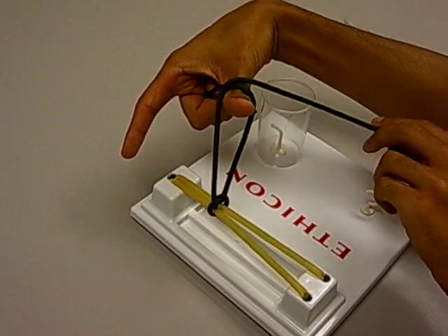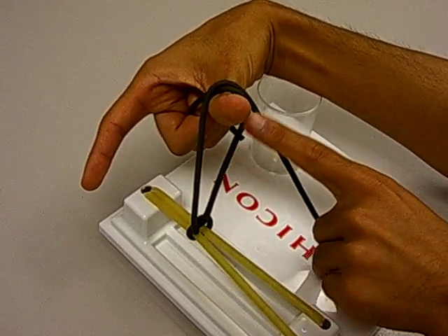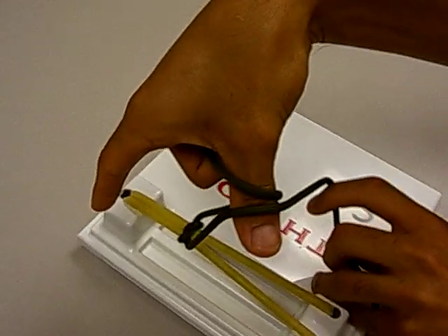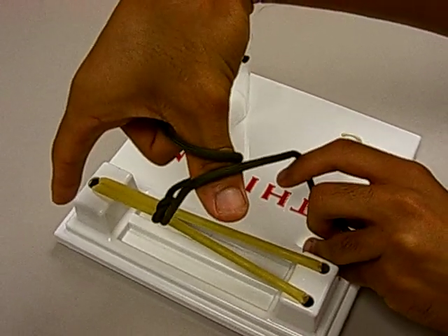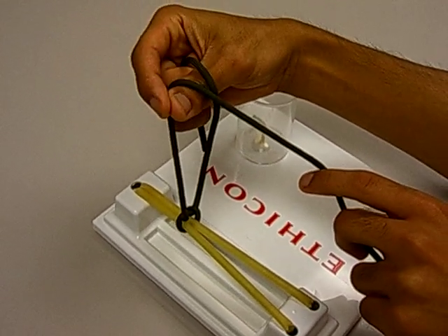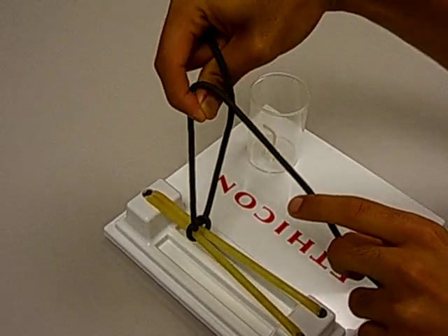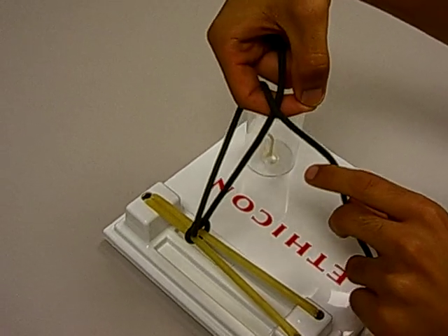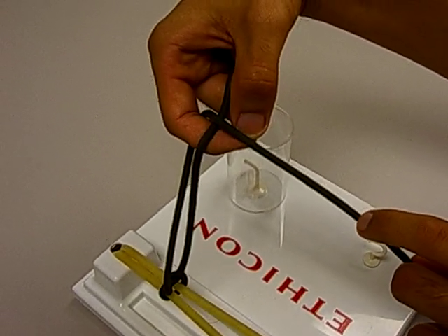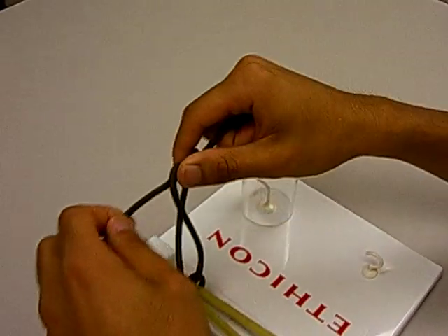Loop the string in your left hand over your thumb like this. You can see that loop again here — loop over your thumb — and above your thumb the strings are just parallel. Now like previously, connect your thumb and your index finger. Push your index finger through the loop that you just made. Place the string in your left hand between your thumb and index finger and then pull it back through the loop.